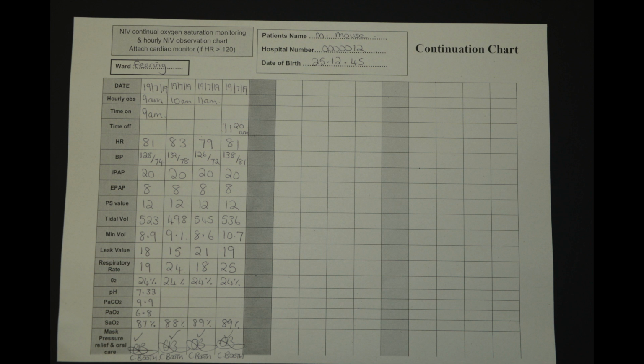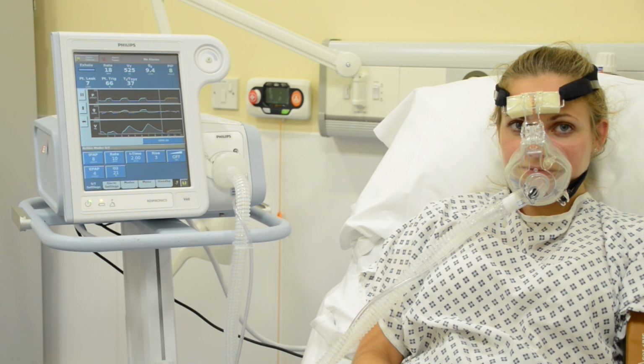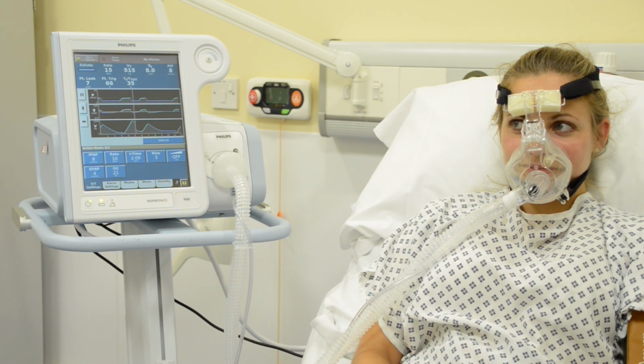Fill out the NIV documentation, NIV communication and progress page, OBS charts, care plan, and of course input the observations also on Vital Pack. While taking observations, note the patient's synchronicity with the ventilator, their chest wall movement, any use of accessory muscles, and their respiratory rate.